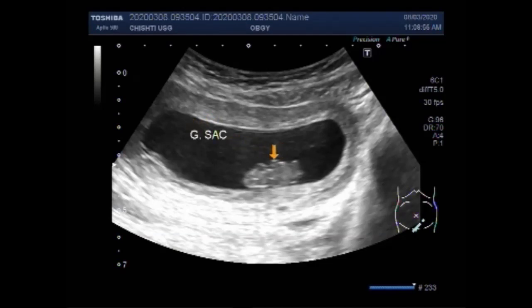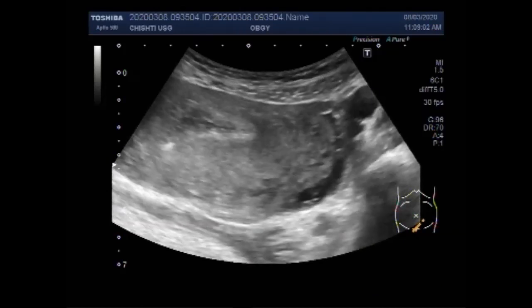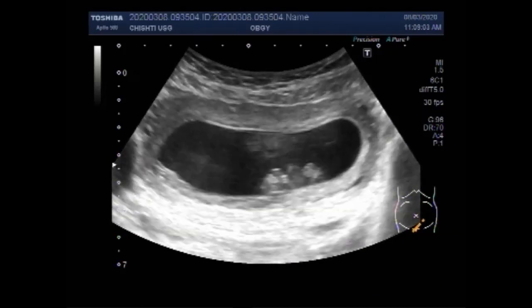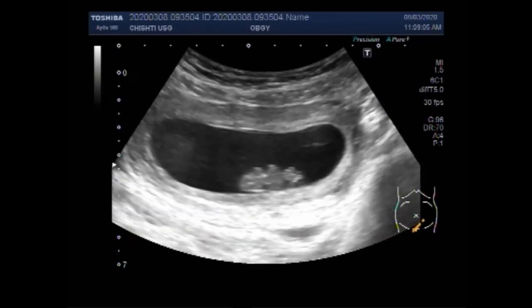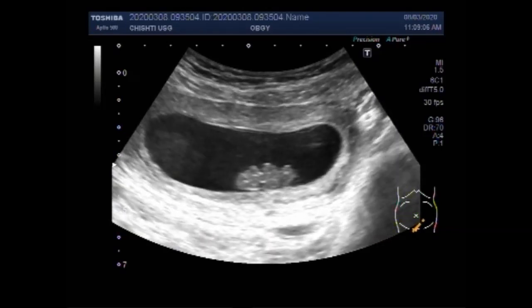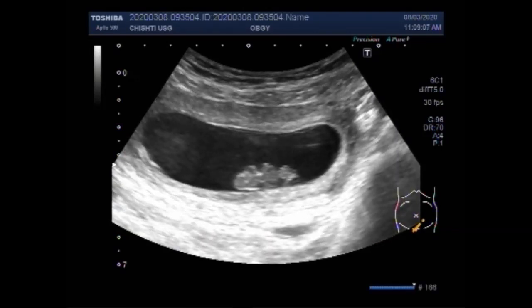You can see the fetus in the gestational sac. The fetal heart shows no cardiac activity.